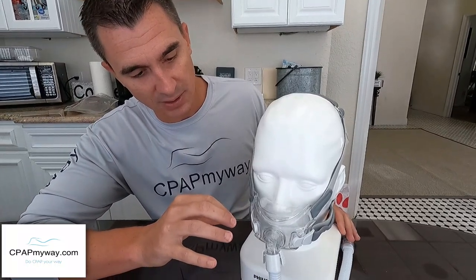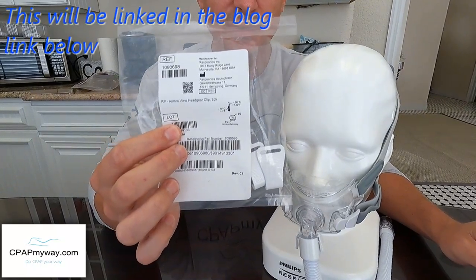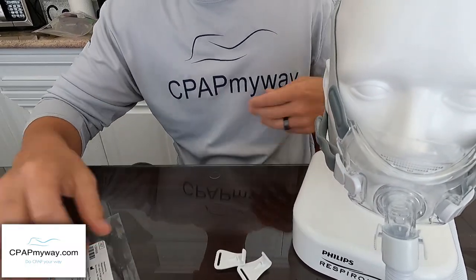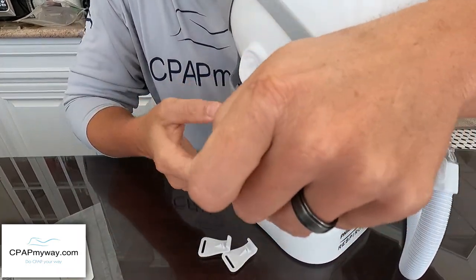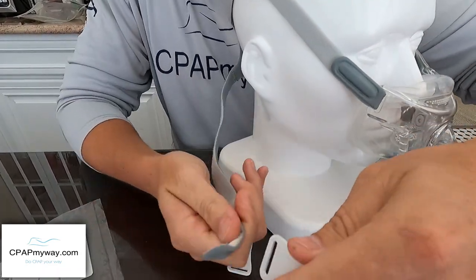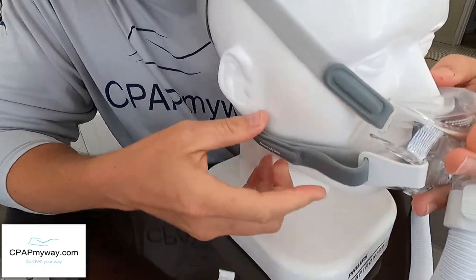If you've got this mask and you want to keep on using it, the only thing you have to do is get our nifty old school clips, which do not have magnets. And what you would do is obviously get these clips out. I'm just going to do one side for the sake of showing you shortly here. Take the whole magnet assembly off of the front of the mask because it literally just clips into place. So now you've got the whole magnet connection here, all right? Slip on the old school clip and it clips right into place. You're good to go, no more magnets. Obviously, if you're the person that doesn't need to be around magnets, you should probably have somebody else do that for you, but an easy resolution to this mask if you want to keep on using it.